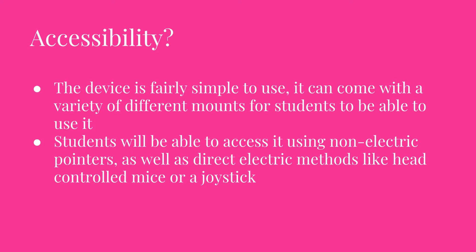Okay, now for accessibility, I feel like this device is pretty easily accessible. It's fairly simple to use. It comes with different mounts and carry cases and different things like that. There's a wide variety of ways that students can access it themselves. They can use non-electric and direct electric methods. So it's fairly easy to use. It should be easily accessible, so students with different disabilities or limitations should be able to use it.